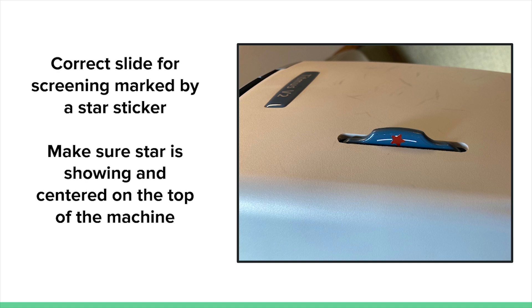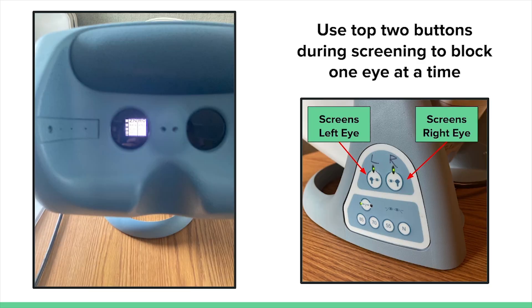Before screening, make sure the star sticker is visible and on top of the machine. With the correct settings in place, you are ready to screen. Ask the subject to place their forehead on the padded rest and look into the viewing end of the machine. The top two buttons on the leg of the machine will block one eye at a time. To screen the right eye, press the button on the right, which shows an image of a person's left eye being blocked. To screen the left eye, press the button on the left, which shows an image of a person's right eye being blocked. The subject should keep both eyes open throughout the screening.